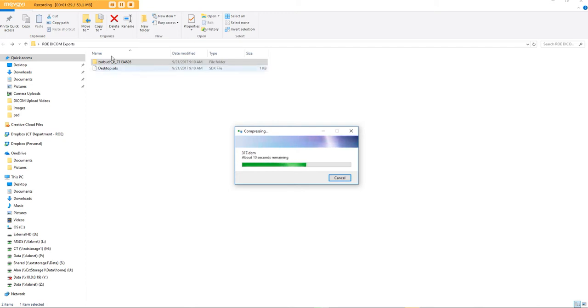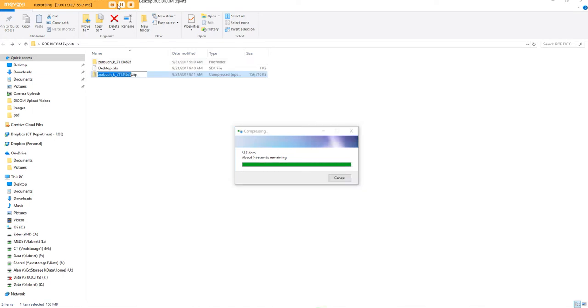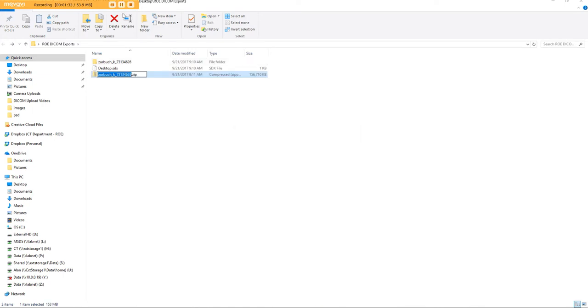We'll watch the video all the way through, and there's your zipped folder. That's what you'll grab when you upload.